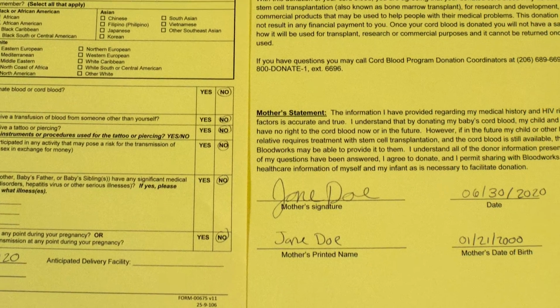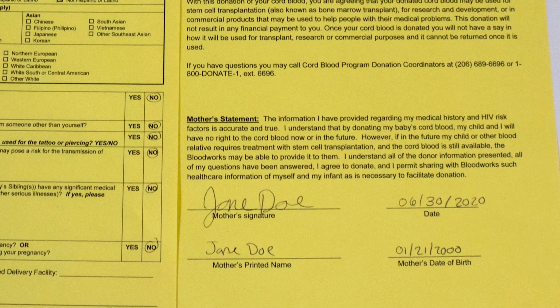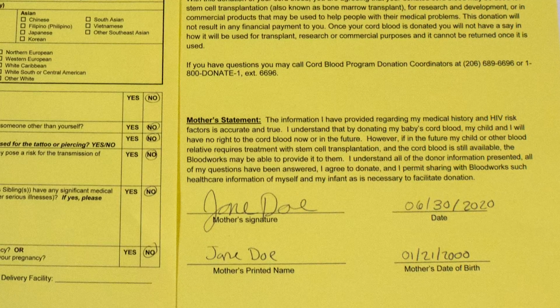The patient will also need to fill out a consent form notifying us that they understand what the cord blood collection is and that they signed the consent prior to the cord blood collection. The following forms are for hospital staff to complete.